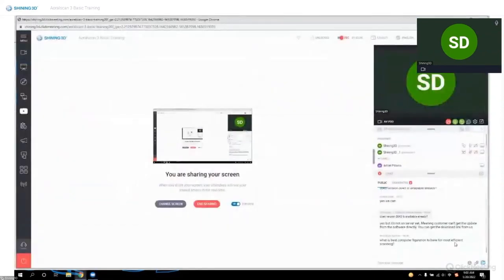And let me check if you have any questions related to it. What is the best PC configuration to have most? So my colleague will answer the question for you. He will type something. It will be more clear. So do you have any questions related to the orthodontic simulation function?